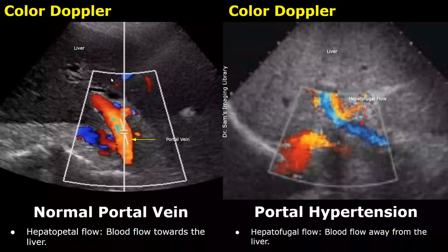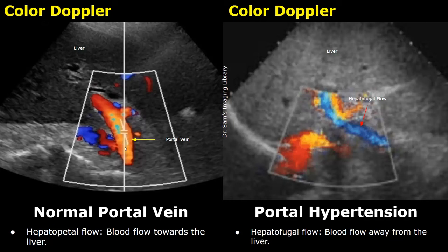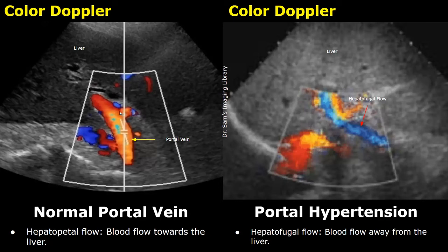This is an image of a normal portal vein with color Doppler applied. The red color indicates that the flow is towards the probe, and this is the liver, so the blood is flowing towards the liver. This flow is called hepatopetal flow and it is seen in normal portal veins.